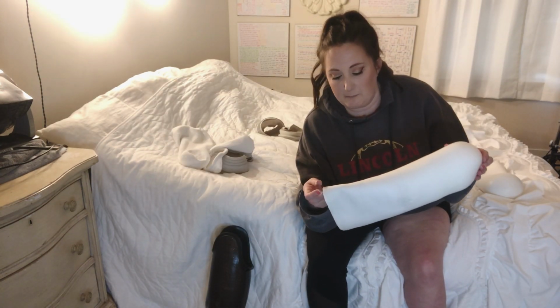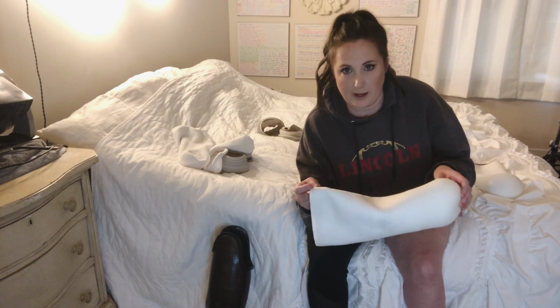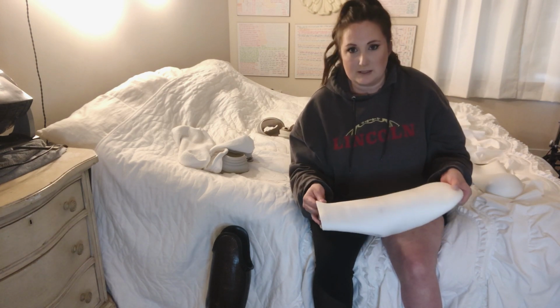Because this has a silicone outside, it's like a magnet for any sort of lint or hair, and I try to keep it as clean as possible. I prefer this liner because it is more broken in. If you can see the knee area, it bends to my knee, and I just prefer this liner more.